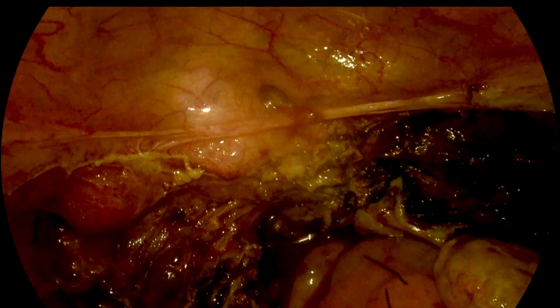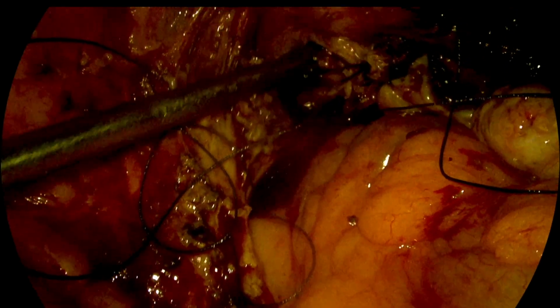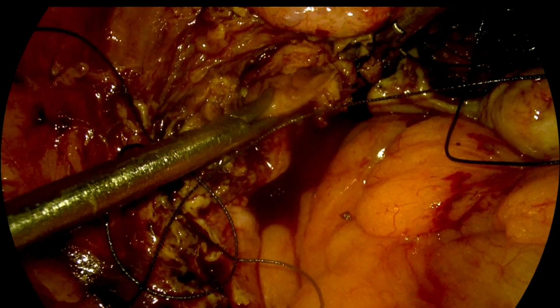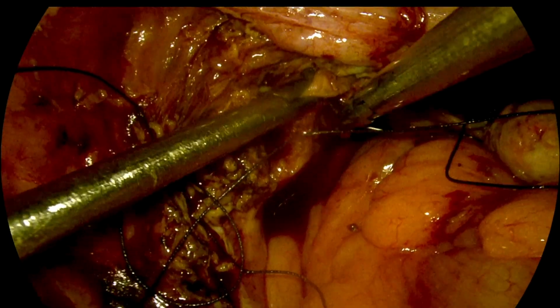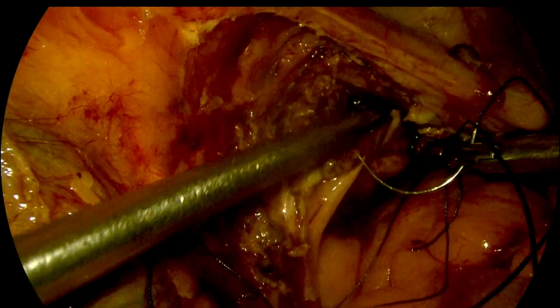So now we have just ligated the right uterosacral ligament, and the right part of the vagina is closed. And then one will take one more stitch from the center, and then from the left uterosacral ligament, which will be attached back onto the vault of the uterus.